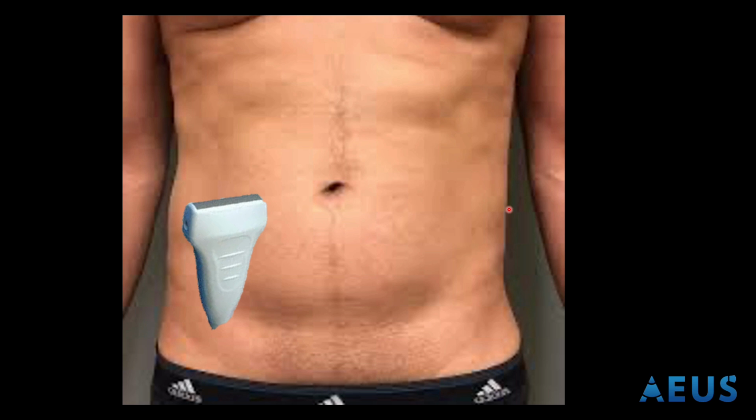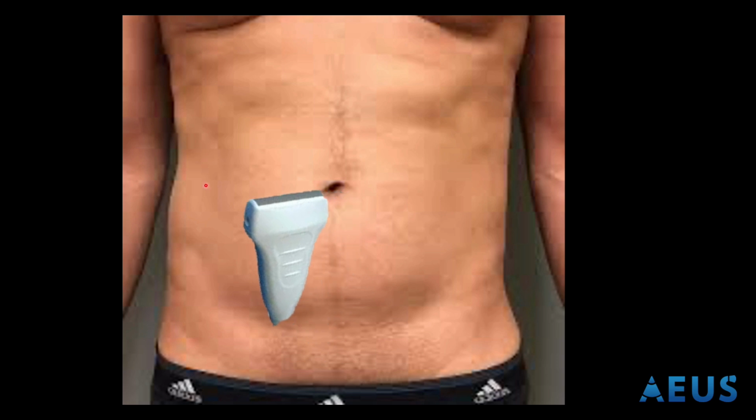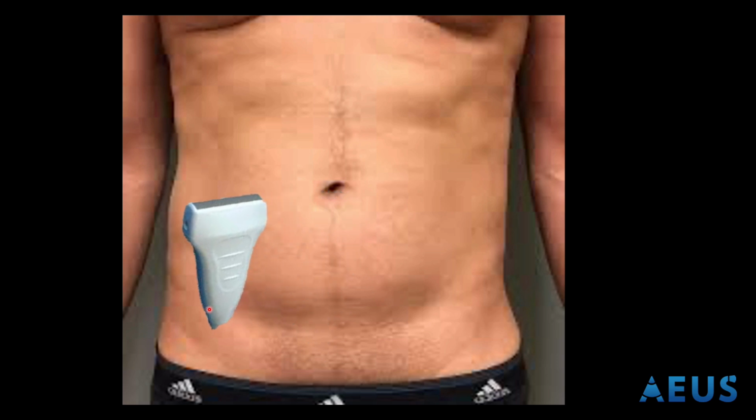In the case the appendix is not seen immediately or around the region of maximum point tenderness, I like to move the probe slightly towards the head, followed by coming down towards McBurney's point, down towards the legs, followed medially towards the suprapubic region, up towards the umbilicus, and back to the lateral side. These are the directions I tend to follow, shown by these arrows.